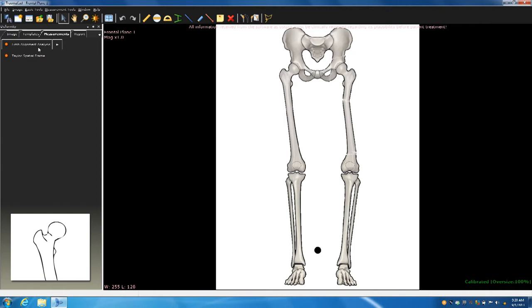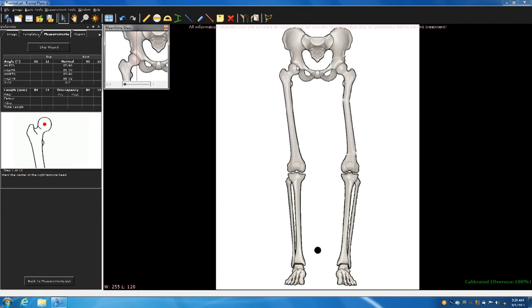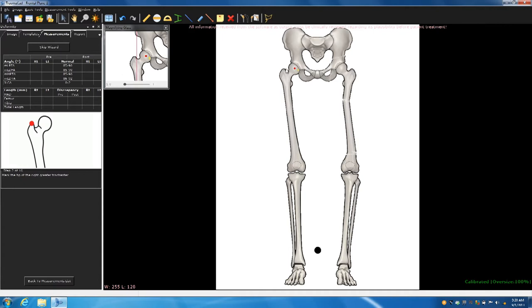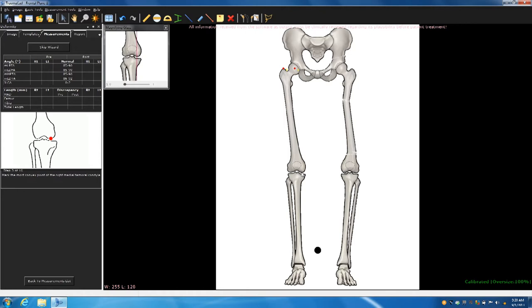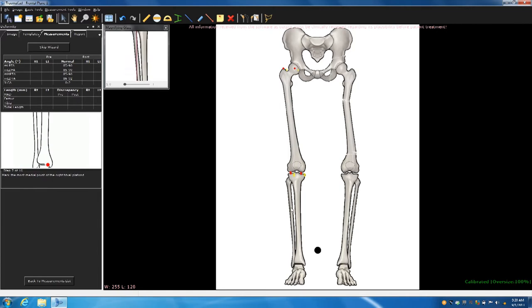So now at this point, you go into the map, right? We're going to do the map. Go up to limb alignment analysis and click on the arrow, and it gives you a choice of unilateral or bilateral. Go ahead and choose bilateral so we can do a full assessment. As soon as you hit bilateral, you'll have this little magnifying glass, and as you scroll over the image, it's magnified, and now you follow the wizard. The wizard's telling you to put a dot in the center of the head, and it says put a dot on the greater trochanter, and just follow right along.